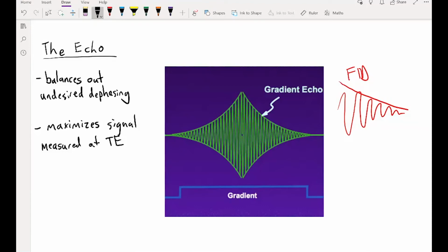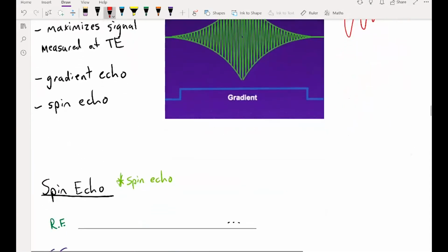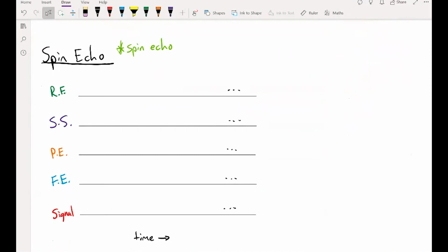We have already talked about gradient echo, which is highlighted on this image that I've pulled from a great website that will get a shout out later. I'm writing image, but I mean to be writing echo. And there's also spin echo, which is very common. It's the counterpart to gradient echo. I would say it's actually more common than gradient echo. It has some advantages, and let's dig into that right now. I'll keep the shoddily drawn FID curve here. I'm going to flesh that out later. But let's jump into what a spin echo does.